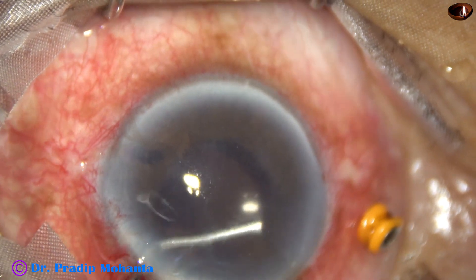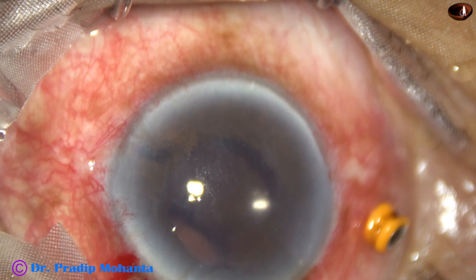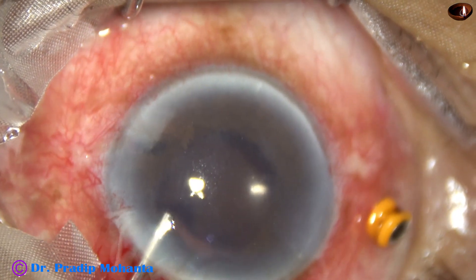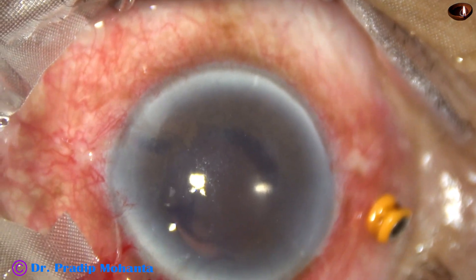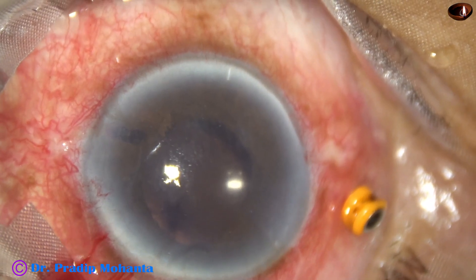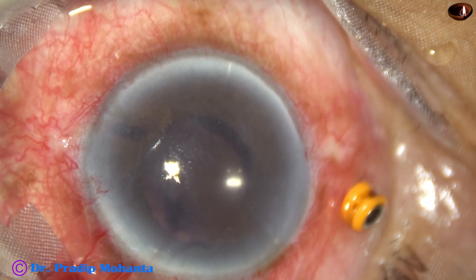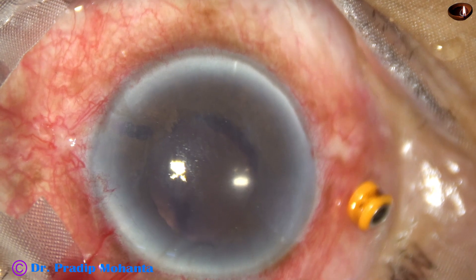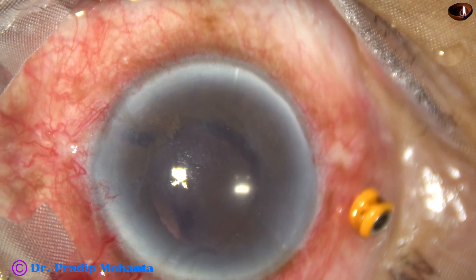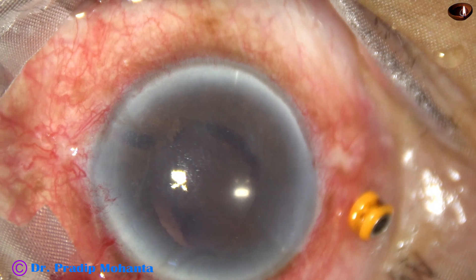Now I inject viscoelastic from the anterior chamber. And now I use a Sinski hook to pull the iris towards the center and separate the iris.